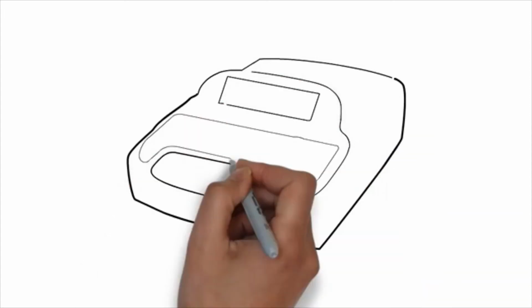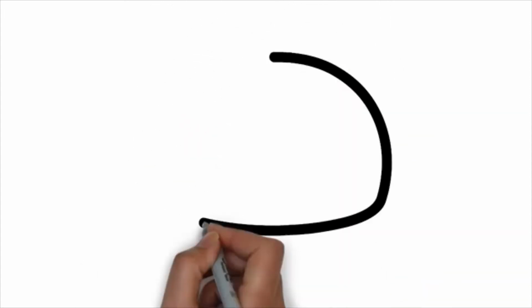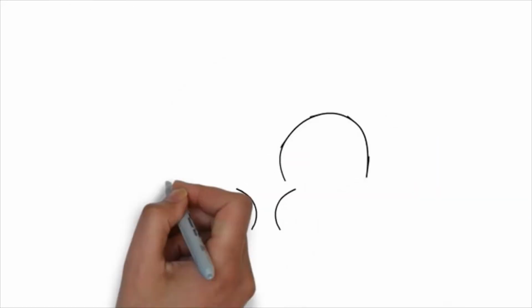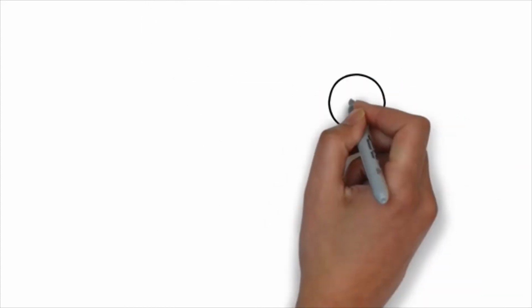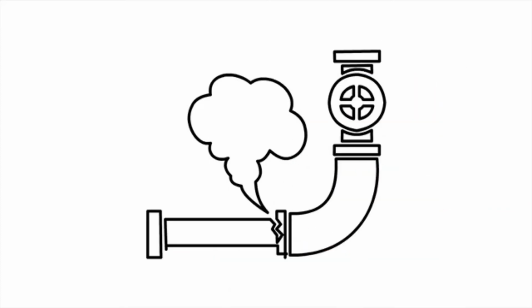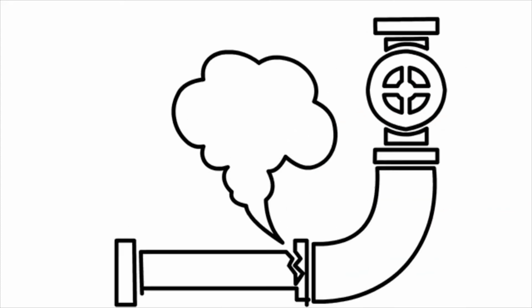Whoa! If the pressure transducer is all that sensitive and the test subject is breathing, doesn't that change the volume and pressure in the breathing zone? Well, yes. So the test subject has to hold his or her breath while the leak rate is measured. Furthermore, the test subject cannot move at all, or the pressure will change slightly, and the system will interpret that change as a leak.